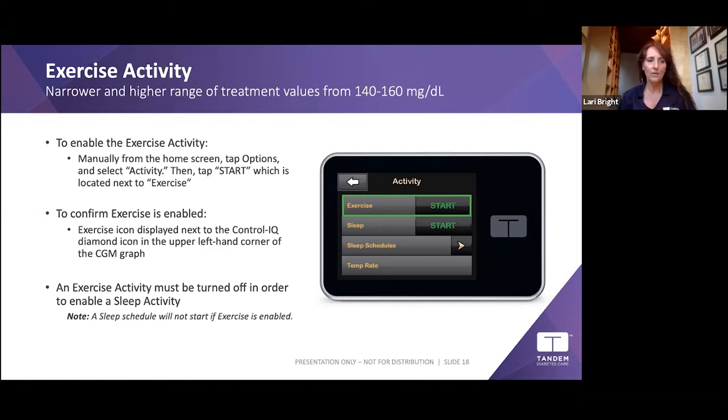To start Exercise Activity, go to your pump, tap Options, tap Activity, and select Exercise. A little running icon will appear on screen so you know it's on. When you're done exercising, tap Stop once your body has recovered. Some providers recommend starting Exercise Activity about an hour before — similar to how you'd set a temp rate before — to let yourself run a bit higher before starting your workout.